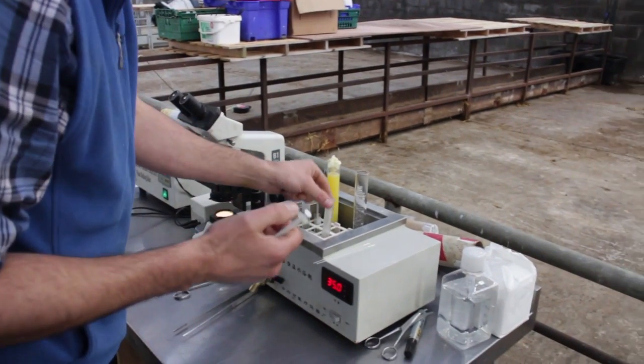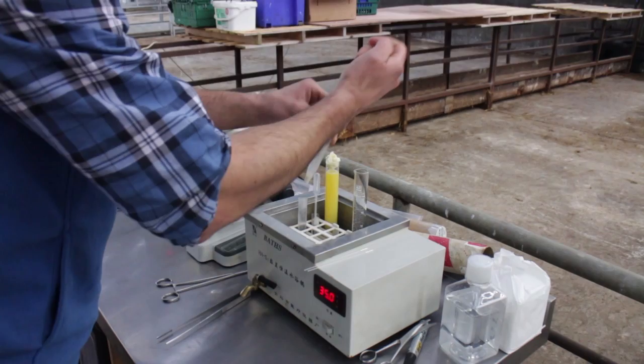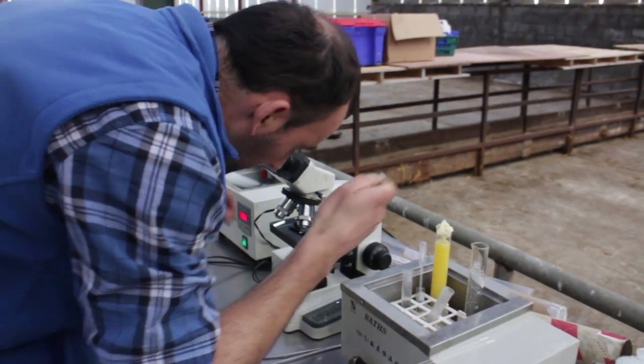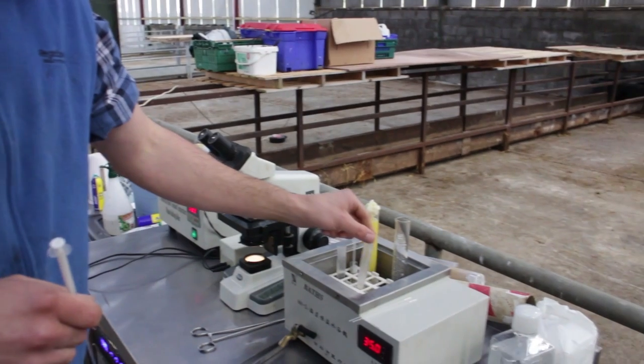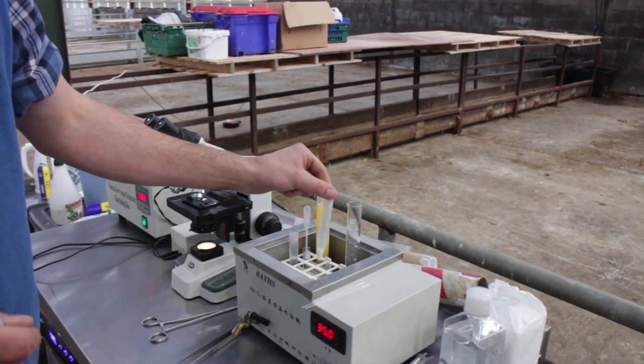I'll take one with a lot of semen, place it on the slide, and take it to the microscope. Really good semen — top quality. It's about 1 mil, and as you can see, the deep milky colour shows it's quite concentrated.